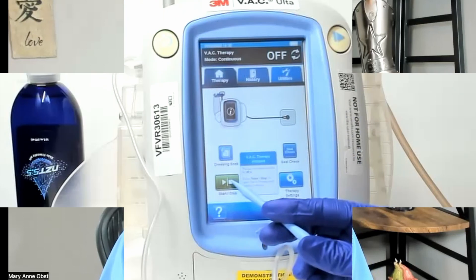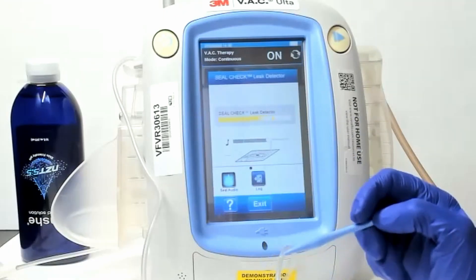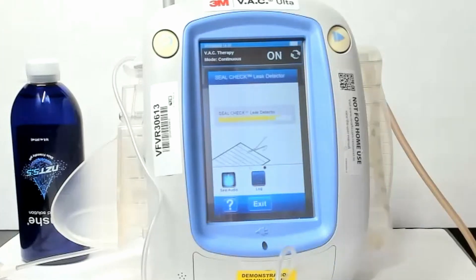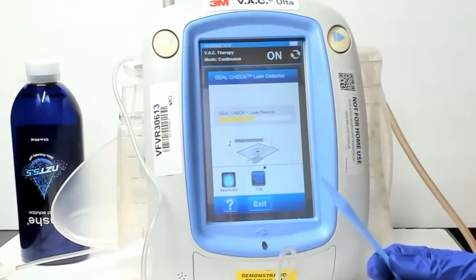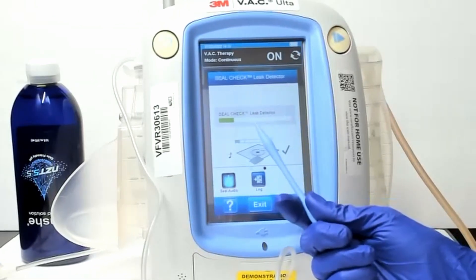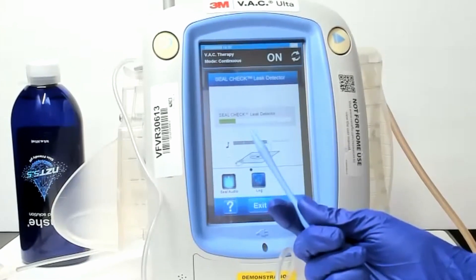So I'm going to do a little bit of a demonstration for you guys — I hope you appreciate it — and I'll see you after the demonstration. When you're getting your initial seal and you have this band coming across, one of the things I like to do is touch the dressing as I watch the seal check. That way, whenever I'm pushing in a spot where it might actually be the leak point, I can see it on the screen.